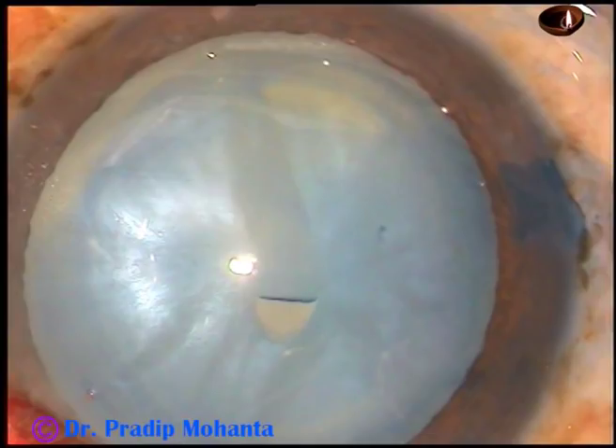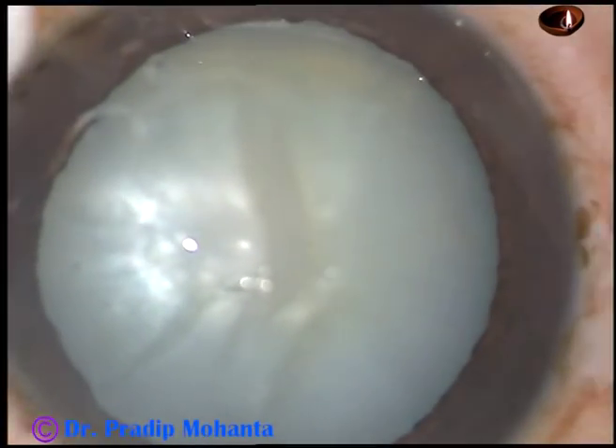Dear friends, this is management of a soft intumescent cataract. Let us observe the surgical steps.